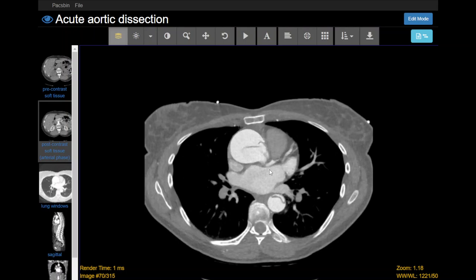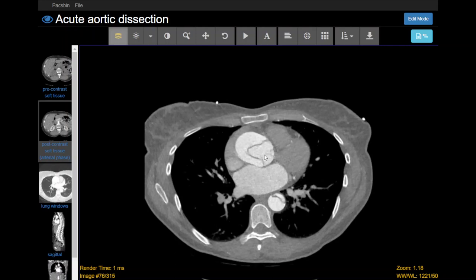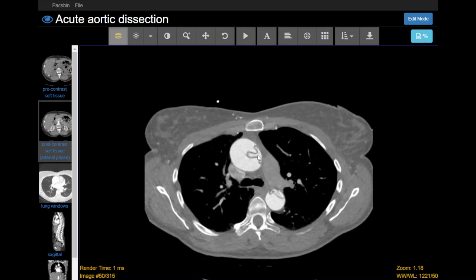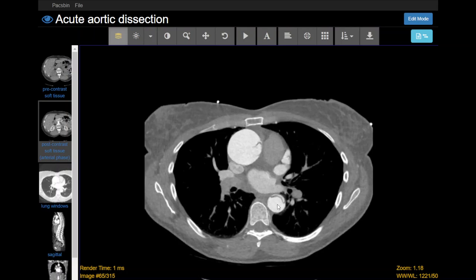First, where is the true lumen and where is the false lumen? The true lumen refers to the lumen of the vessel as it should be, as it arises from the aortic valve. The false lumen refers to the space that's created by the intimal flap. If we follow from the root, we see that this is the true lumen here. The true lumen is much smaller compared to the false lumen, which is not an uncommon finding. Even as we continue following the aorta, we see that the true lumen is very, very small.